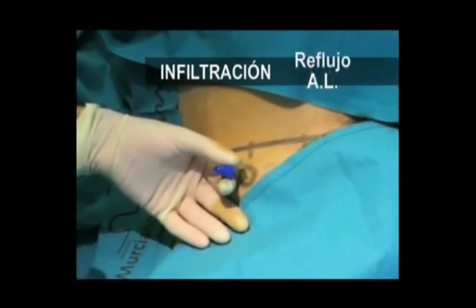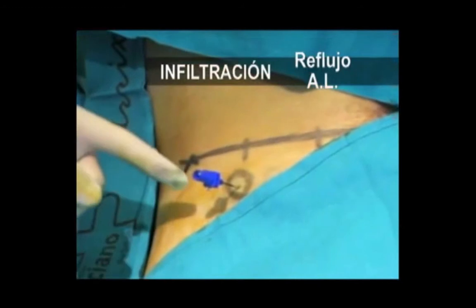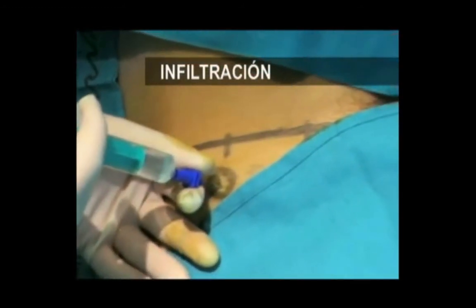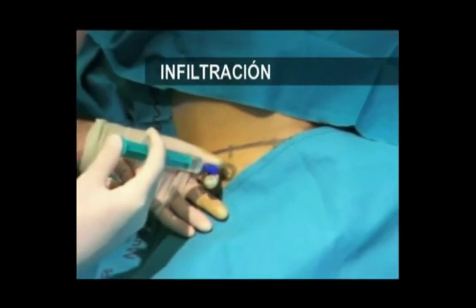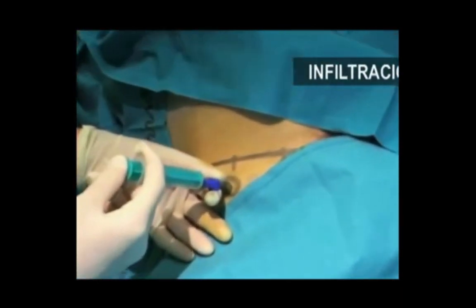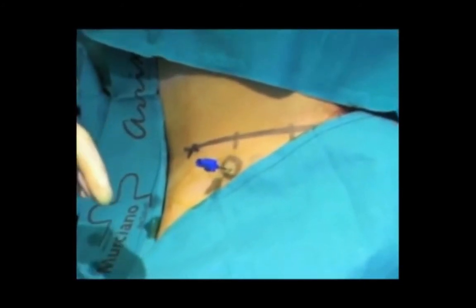Now what they're seeing here is just the local anaesthetic refluxing out. That illustrates it's in a fascial compartment rather than in the muscle body. So that's a positive sign that we're in the right spot. And then they carry on to thread a catheter after they've hydrodissected with local anaesthetic.